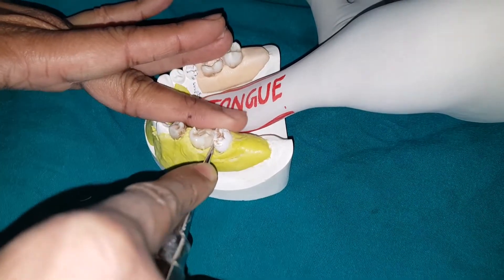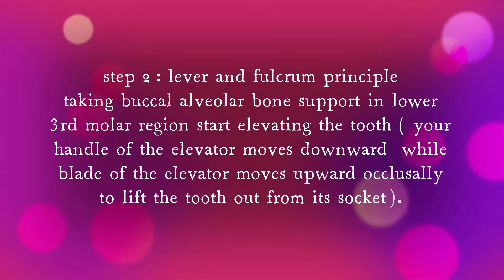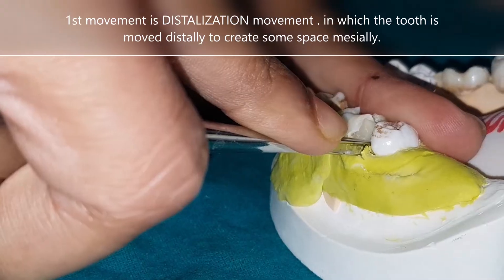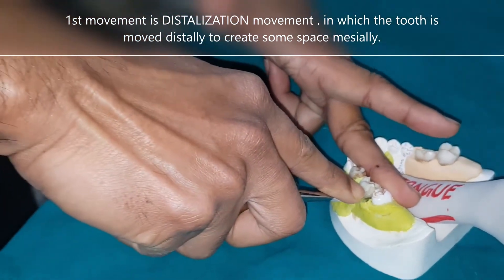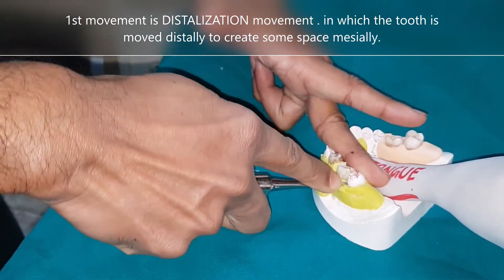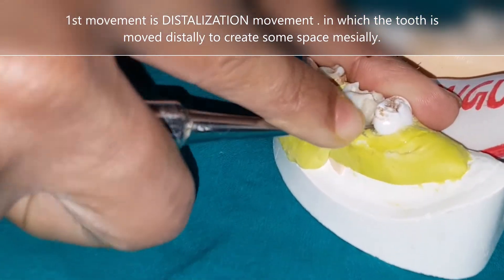The next step is the lever and fulcrum principle. Here you take the buccal alveolar bone as support or as a fulcrum in the third molar region and start elevating the tooth. Once you have wedged, you start moving the tooth distally — that is called distalization movement. It is not yet elevation; it is creating more space between the two teeth and pushing the tooth distally. Look at the rotation of the hand.